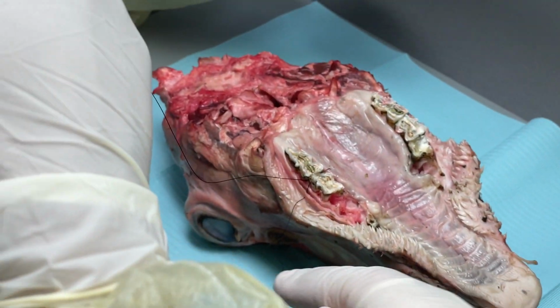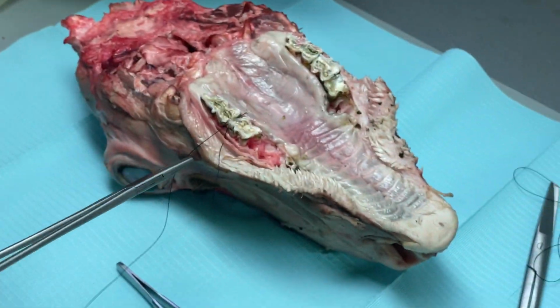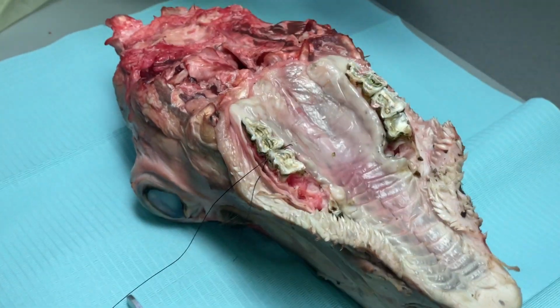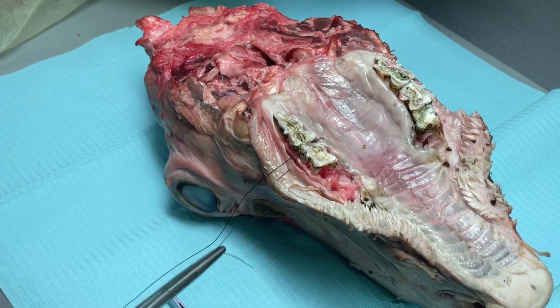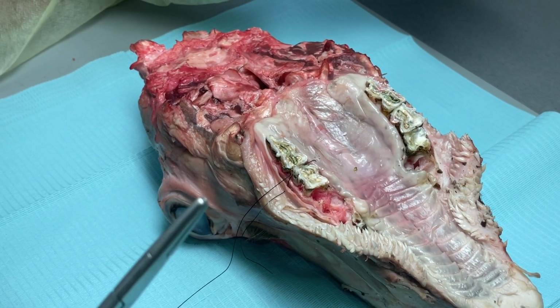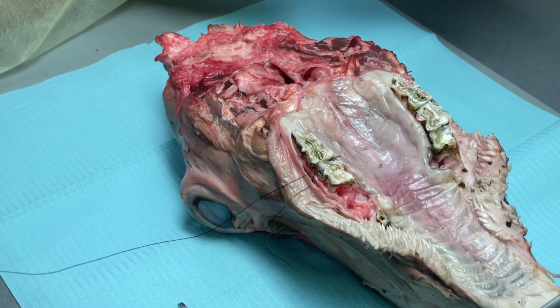The wastage end is this one. If this is longer, once you tie the knot and cut, that goes to waste. So always try to keep this shorter, but enough for you to hold, not too short also. Now see, this much length is there.